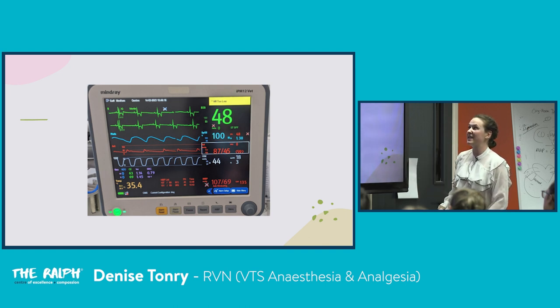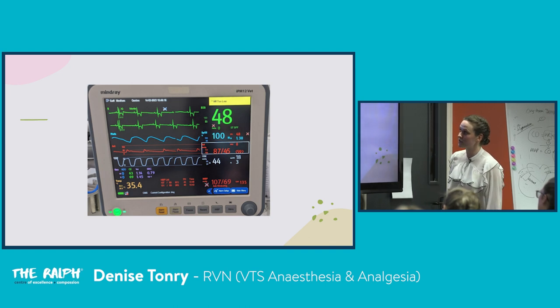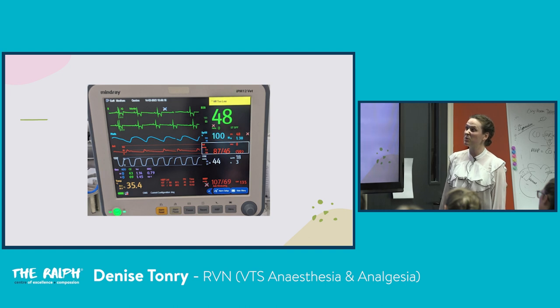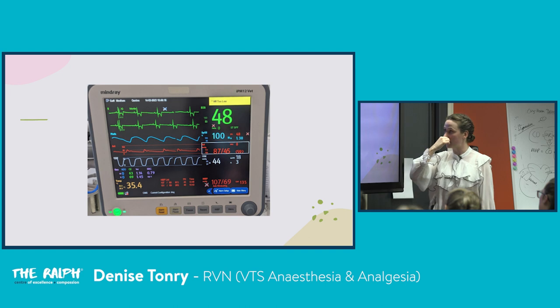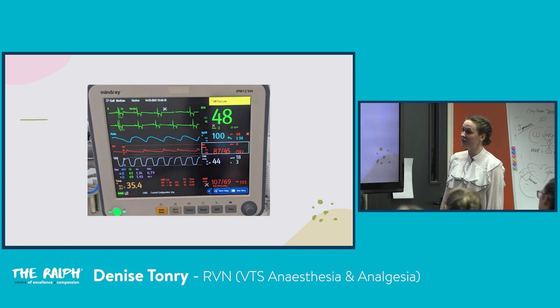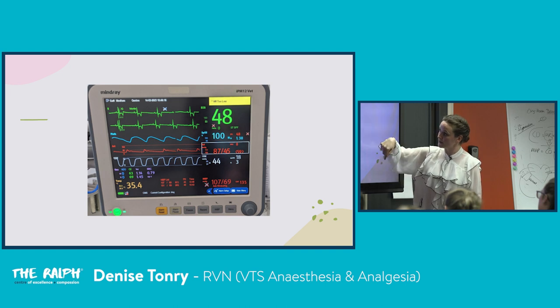But if this was, let's say, a Mastiff, I'm not going to be running outside and saying, oh, it's 48, we need to treat it. But in some cases, I do find the anaesthetist treating the blood pressure a little, because it might just bump it up a bit and bring this up to like 70 where we're happy. And if not, we might go further into more vasopressors and improving contractility, increasing heart rate through other drugs. But this blood pressure, I guess, makes me a little bit uneasy.